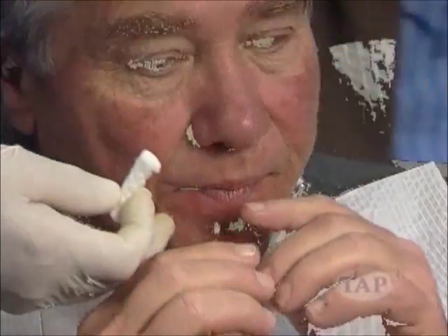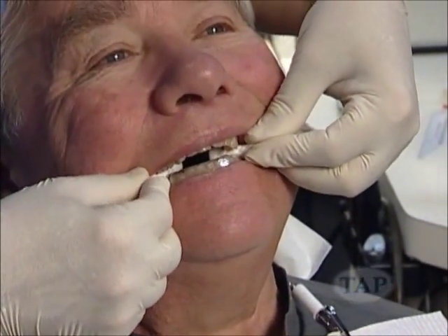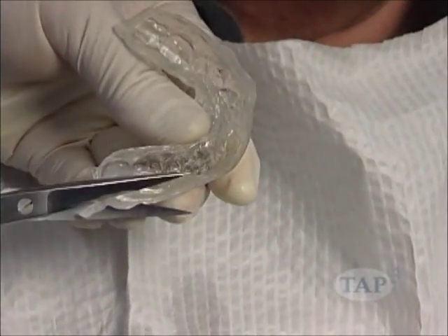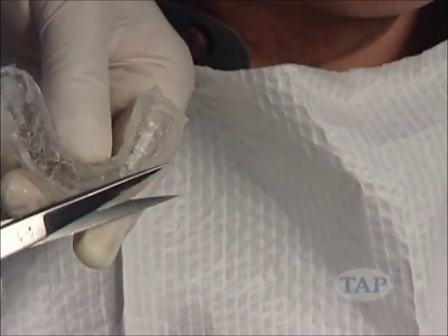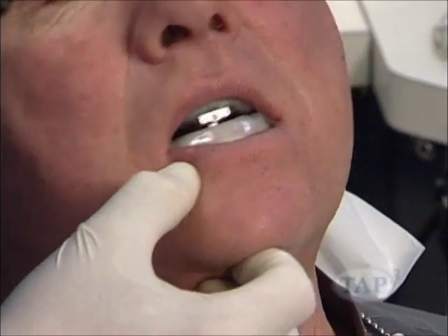Have the patient place the tray in their mouth again and place cotton rolls on either side of the tray to help seat it. Again, have the patient remove the tray. Trim any excess thermocryl and repeat the fitting process if necessary. Once the tray is relined and fitted, place both trays in the patient's mouth. Check for fit, comfort, and retention.